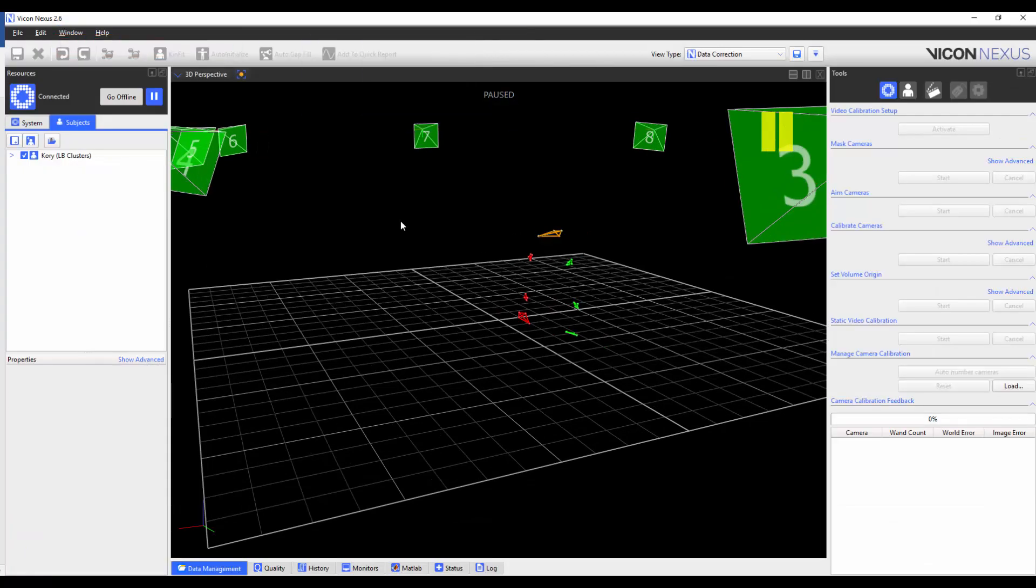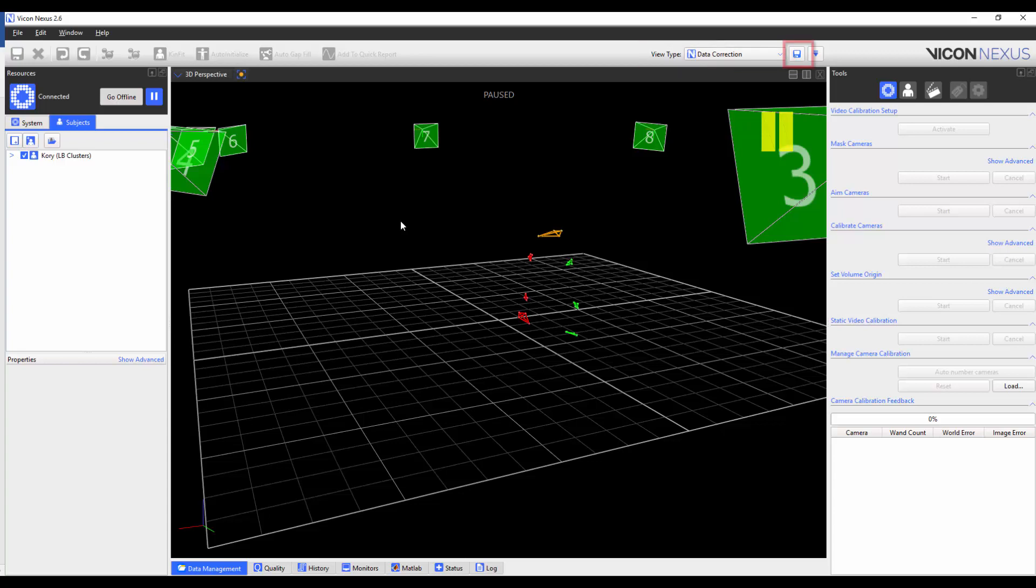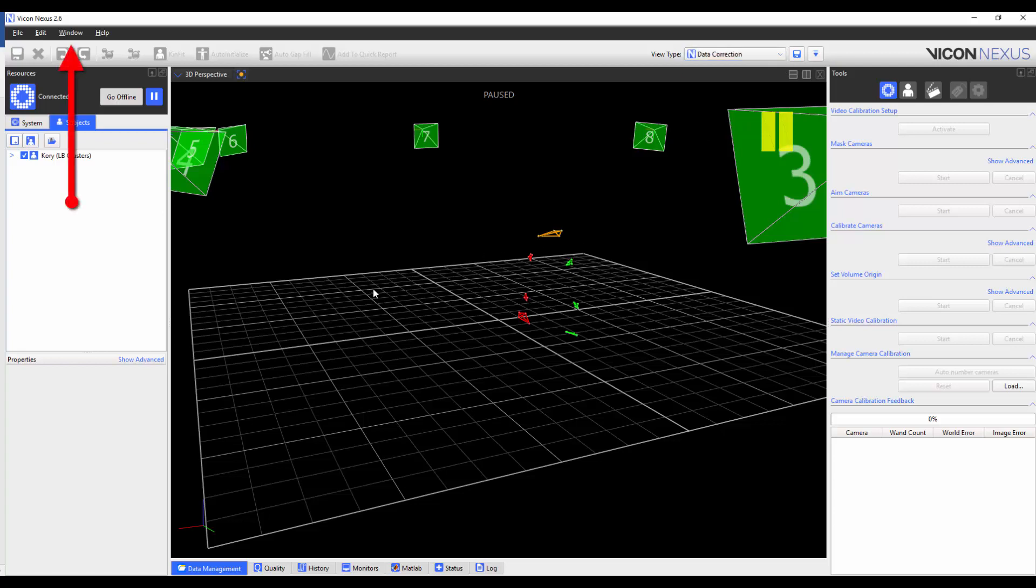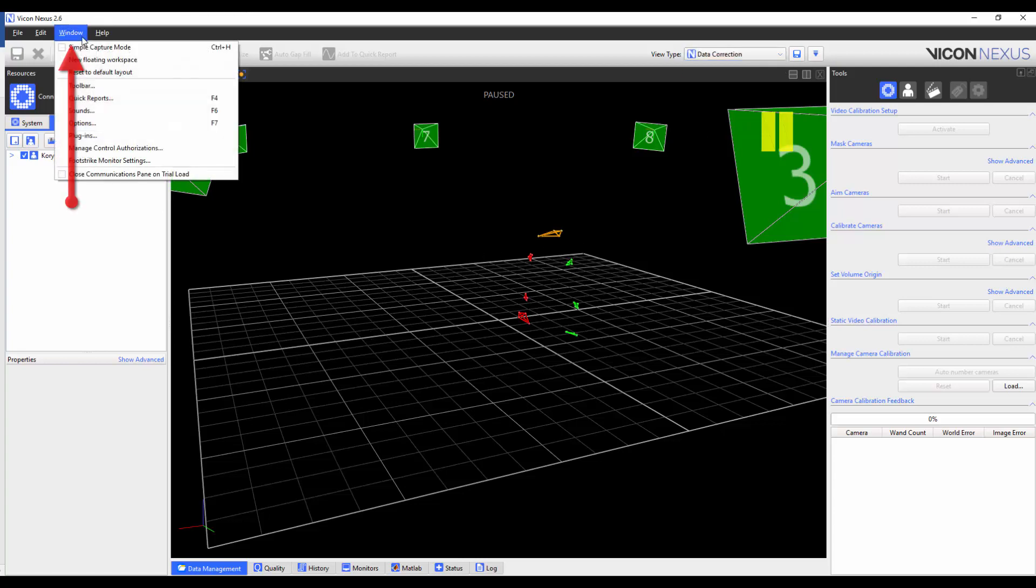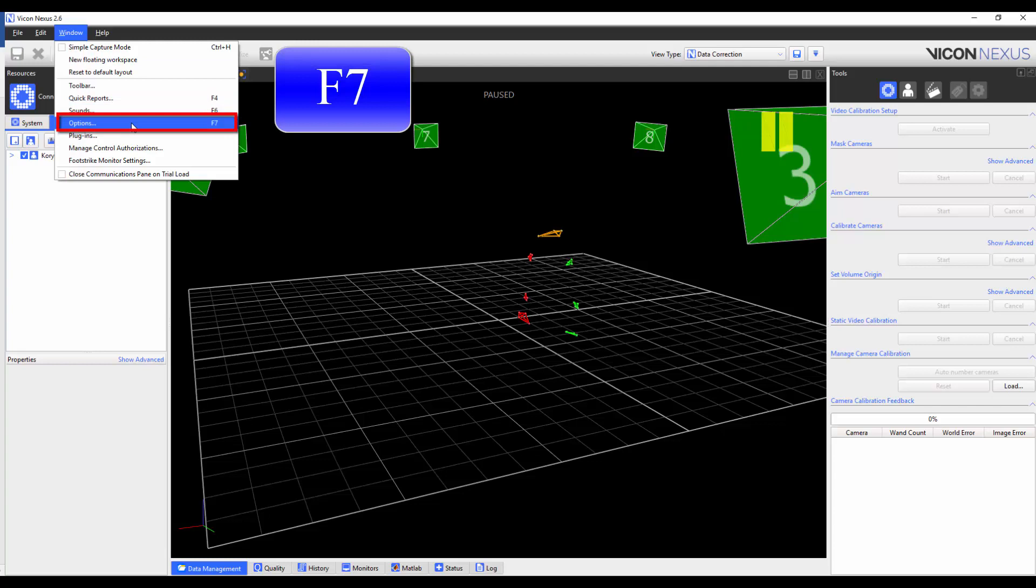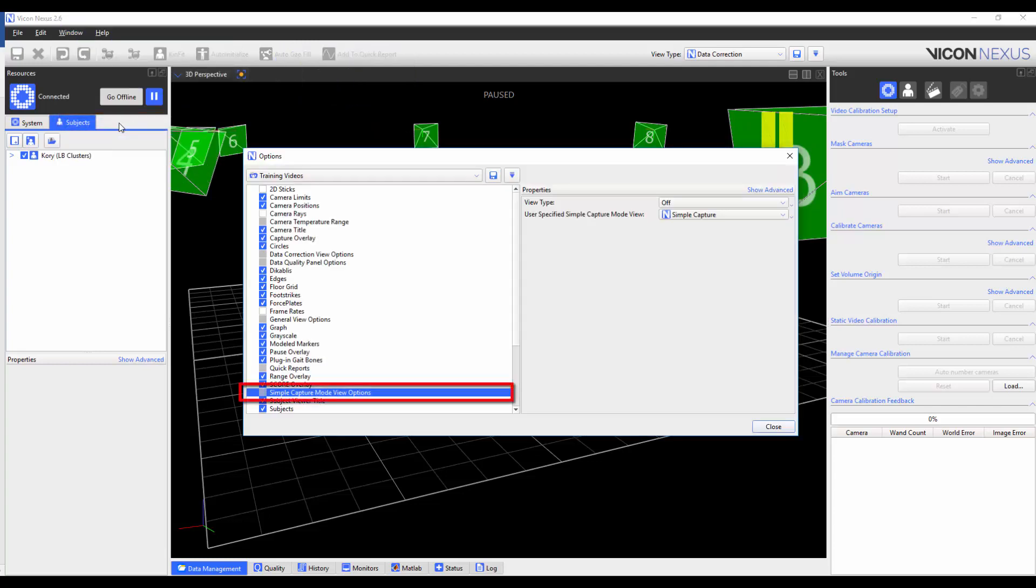You can also set a view type to be displayed once you enter the Simple Capture Mode. You can create and save your own view type, and select that, or you can use one of the pre-made view types. To toggle this on or off, go to Window, Options, or press F7 on the keyboard, and then select the Simple Capture Mode view options.